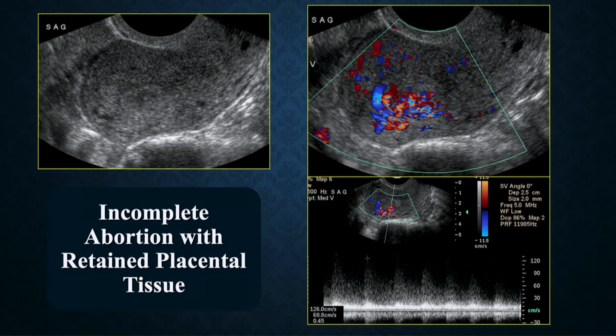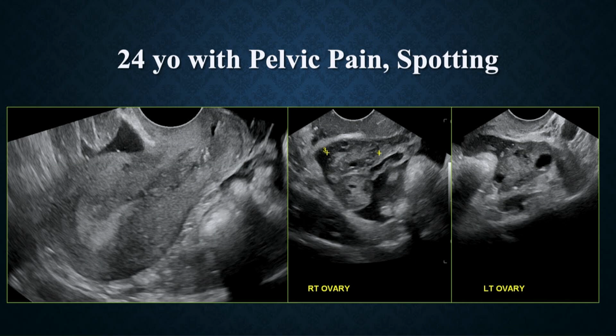If you use a 60-degree angle, because we always think, oh, it has to be a 60-degree angle, you will inflate that velocity too much. So you have to have a 0-degree angle in situations such as this.